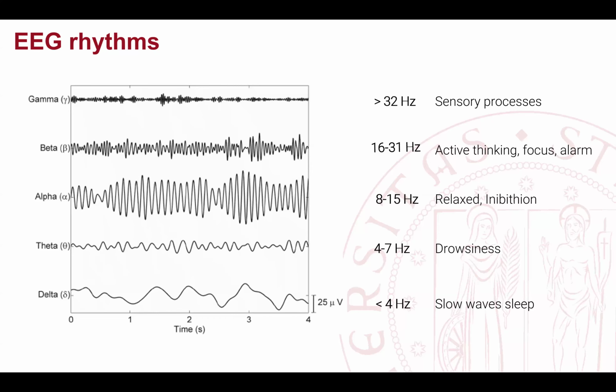So this is the only thing that you can see visually, the synchronization of the alpha rhythms related to some task. Okay, so if you are interested, I can guide you on that even remotely, but it is a very interesting experiment to do, and it's very easy.